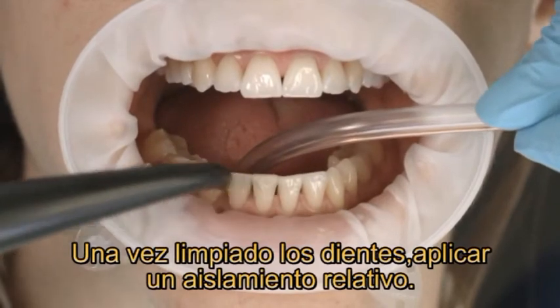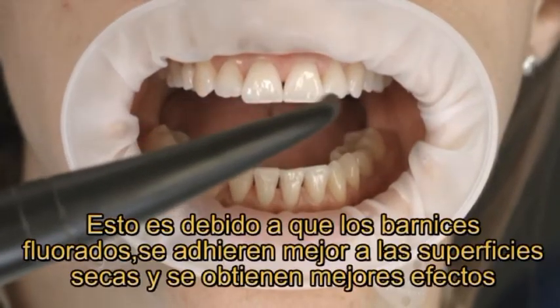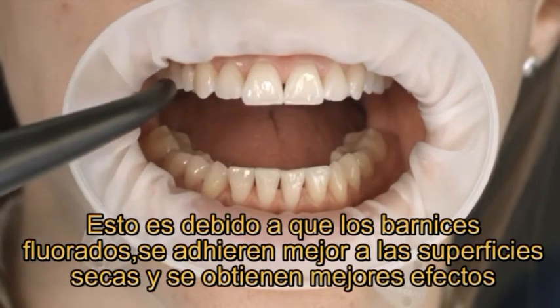Once you have cleaned the teeth, provide adequate relative isolation. This is because varnish systems adhere more tightly to dry surfaces and can take better effect.